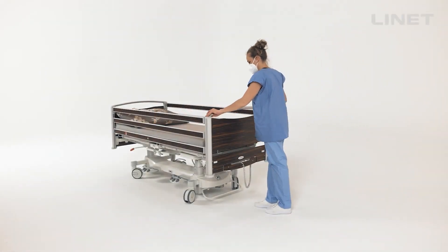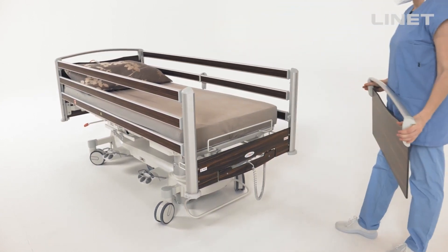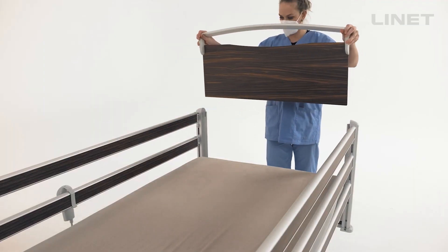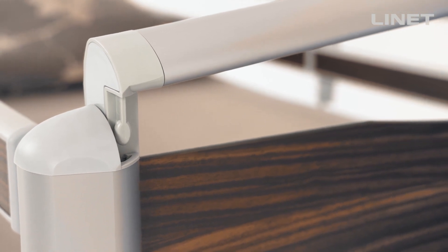To operate with the head and foot end, just lift up the boards on the side where it is needed. There is no locking system, but still there are two hooks which belong to corner posts.